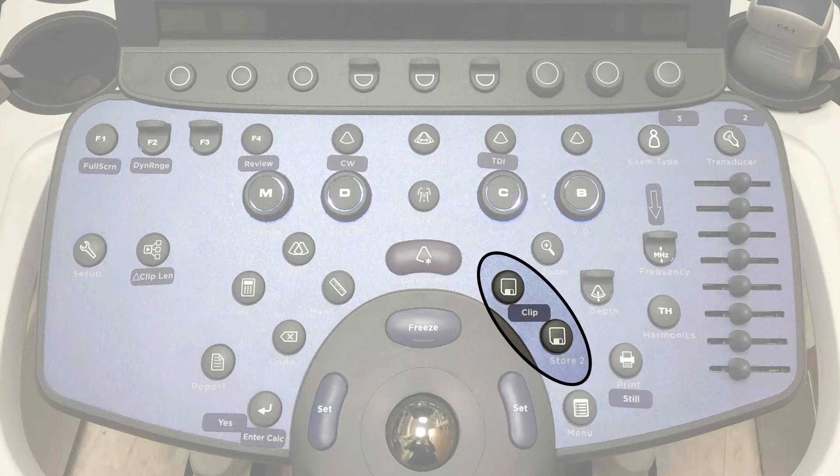To save your images, press the save or store key. There are actually two buttons, and we have configured both to do the same thing. This will capture a prospective six-second clip from when you press the button. You will also see a progress bar on the screen as you are capturing the image. Both keys perform the same function.